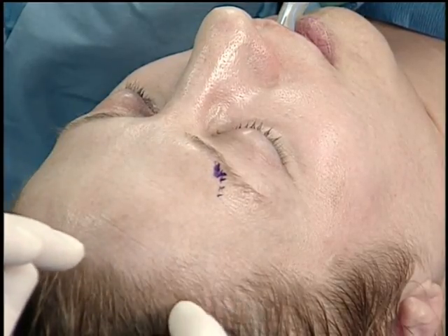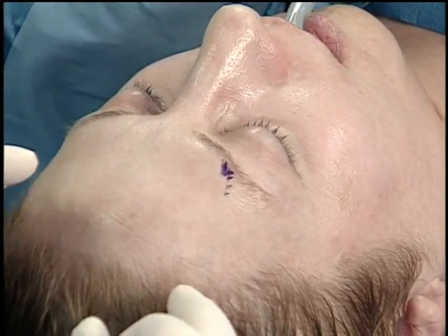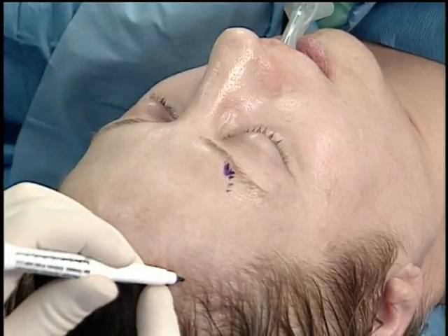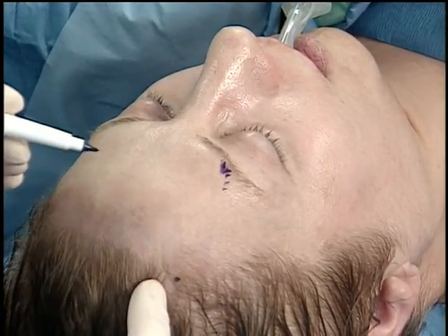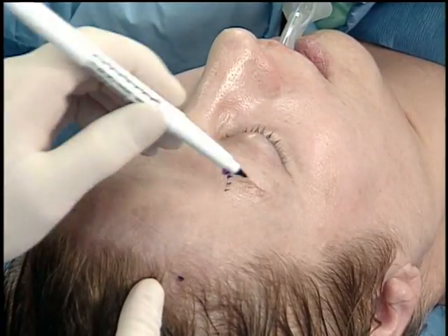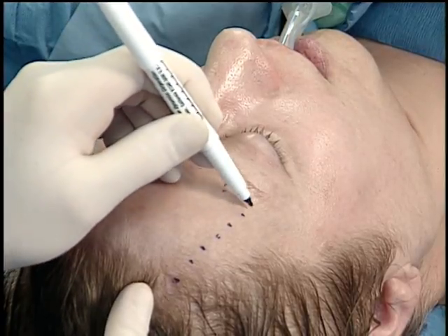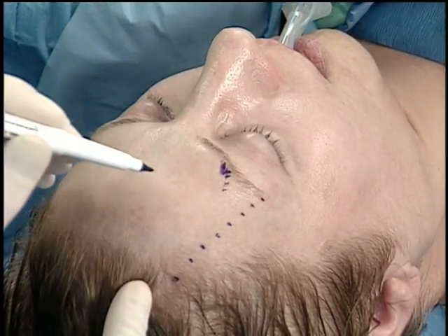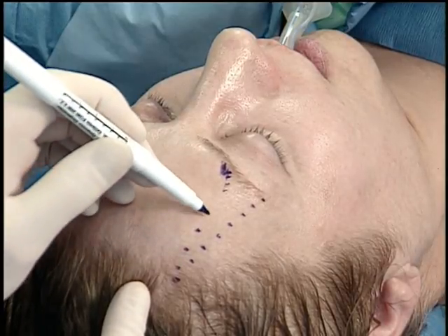With the new articulus thread, we have one common deployment at anchor point, and I usually pick that right in the hairline, back a few millimeters, just in case there's any visible mark left by the deployment and the anchor point. And I want to pick up the tail of the brow. So one of the arms of the articulus contour thread is going to go in that direction. I'm going to come just medial to the supraorbital notch.